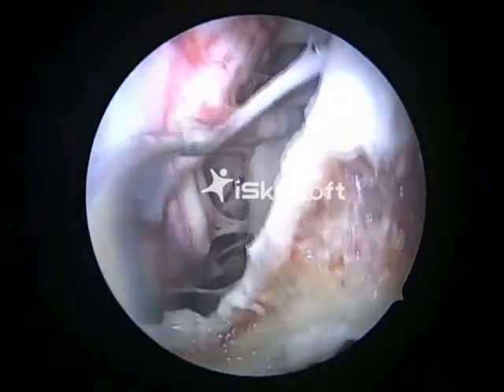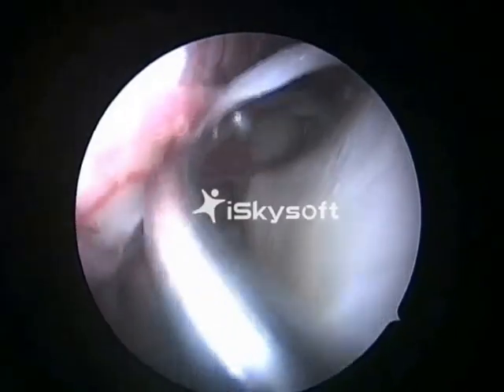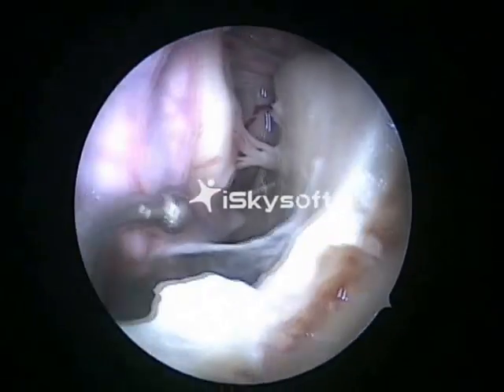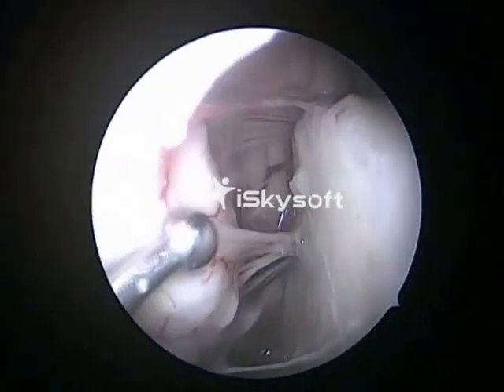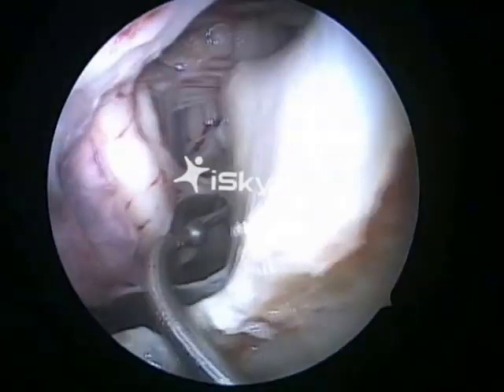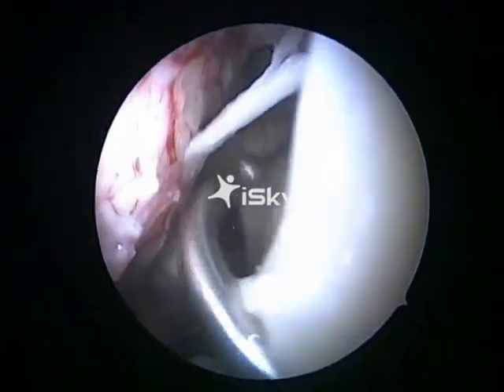Six. You can see the 7 and 8 with the labyrinthine artery. That's the 12. The 9, 10, 11 behind it. 12th is more ventral.